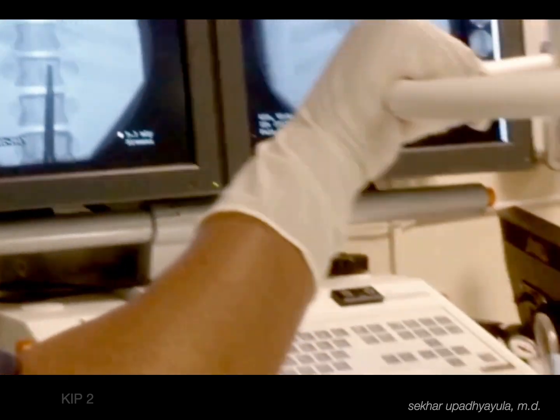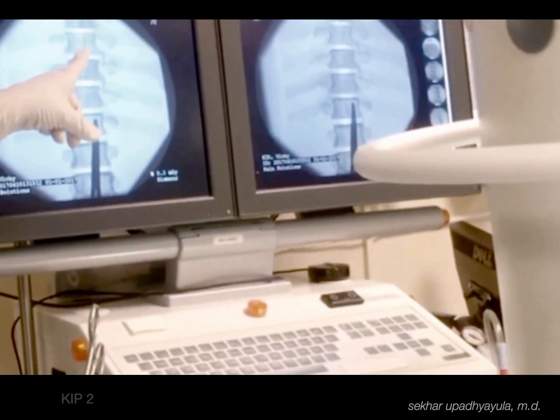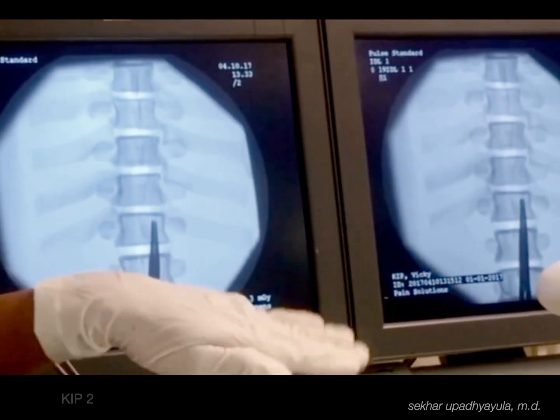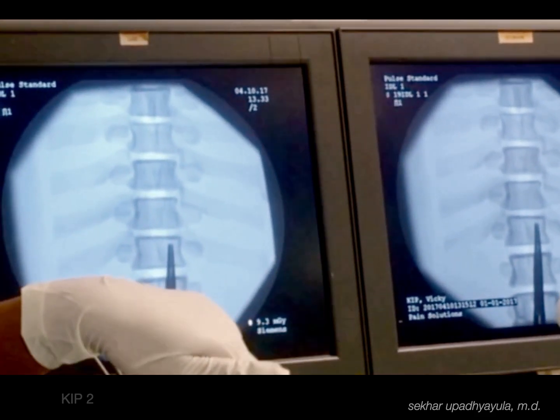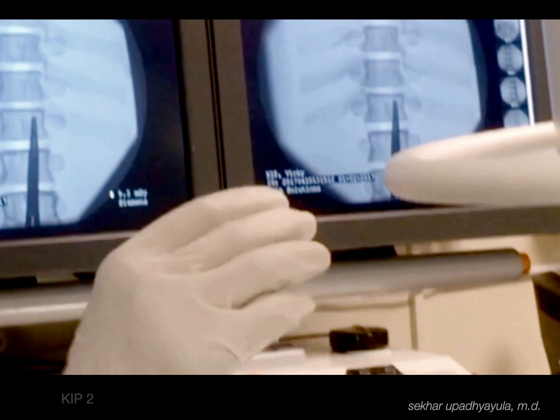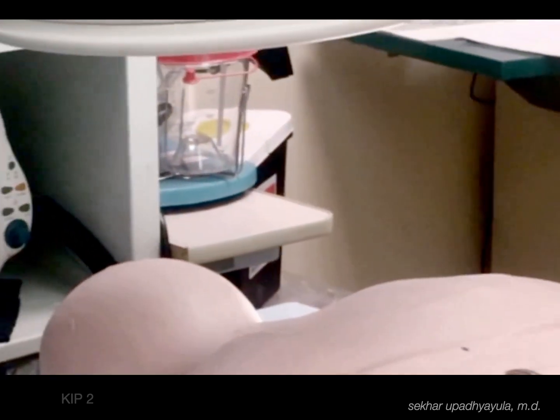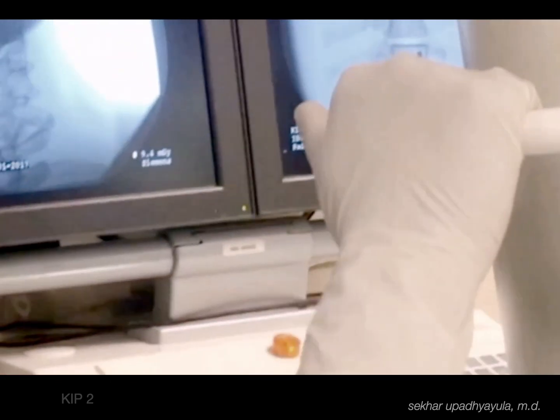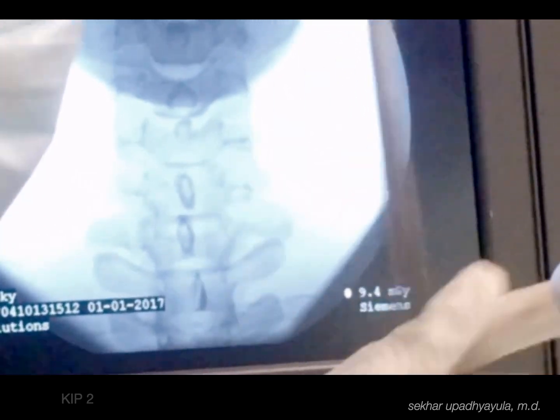Let's move up higher. And a nice touch, as you can see, the spinous processes, like the thoracic spine, are angled sharply downwards. In the lumbar spine, they're more straight. In the thoracic spine, as we go up, they start angling down. In the cervical spine, they start coming back out a little bit. Let's have a look at the neck, all the way up. Well, the neck looks wonderful. Let's head down just a little bit.